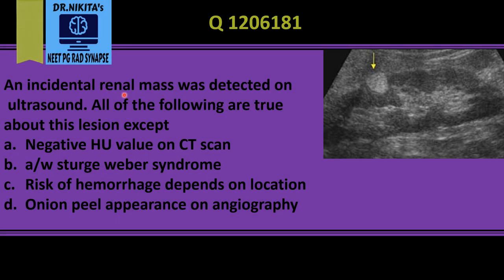An incidental renal mass was detected on ultrasound. This is an ultrasound image showing the kidney, and we see a well-defined hyperechoic — that is, white — mass in the kidney. It is uniformly hyperechoic or echogenic, which indicates fat, since fat is hyperechoic on ultrasound. So this is a fat-containing lesion.